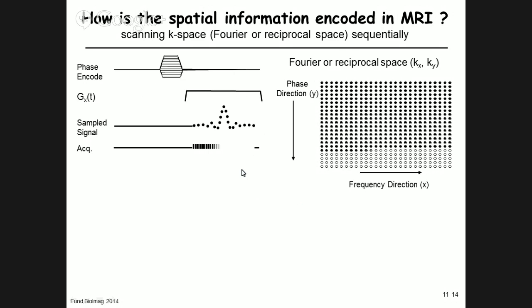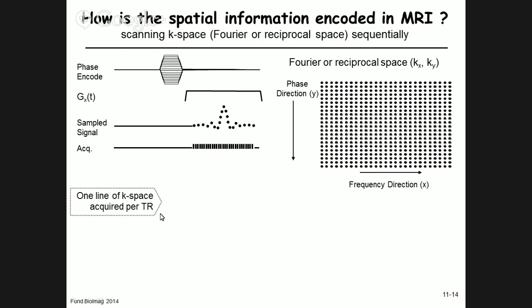That's when you hear the MRI, it goes bzz, bzz, bzz. That's exactly what you hear. So you actually hear the filling of the two-dimensional matrix. You just hear the different phase encode steps in the experiment, and then we're done. We've got the data in there, and we can Fourier transform.